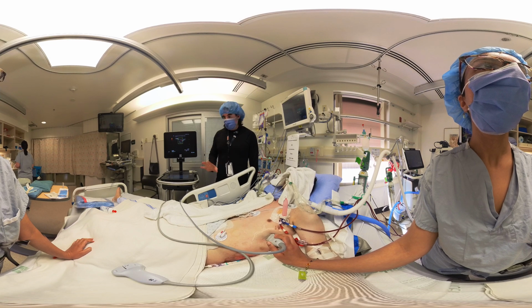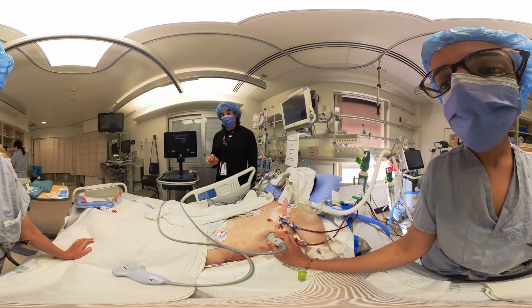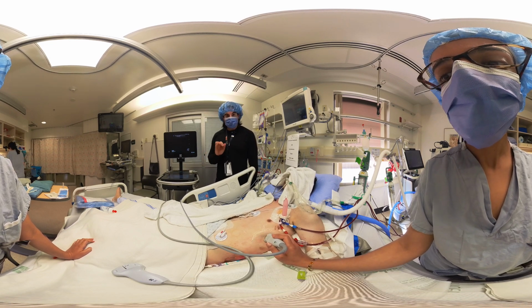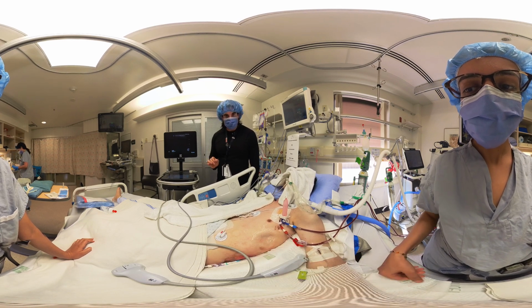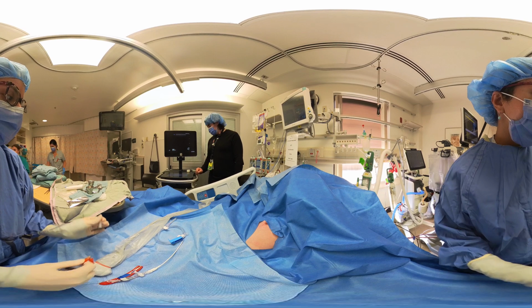So now that we're happy with the space, we're going to go ahead and prep the skin and drape the patient and then start with the procedure from there. And we'll introduce all the instruments.